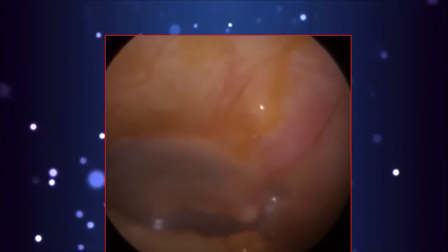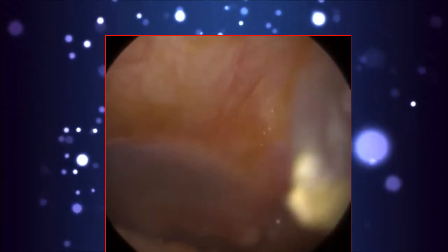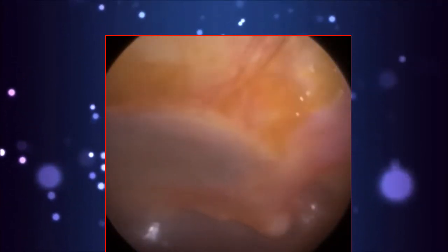So there's a little tube behind the eardrum called the eustachian tube that connects to the back of the nasopharynx, or the back of the nose. And that tube is predominantly shut closed, and during brief moments of yawning, swallowing or chewing, that tube momentarily opens, which then allows for the equalization of air pressure, and that's when we hear the best. So it's just a bit of wet sticky wax on the anterior canal wall. Just remove that. Patient's eardrum is otherwise intact and healthy.